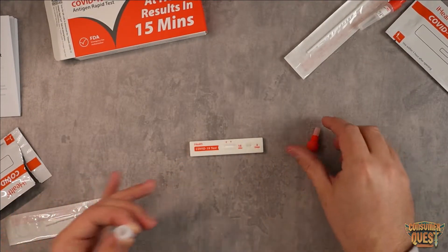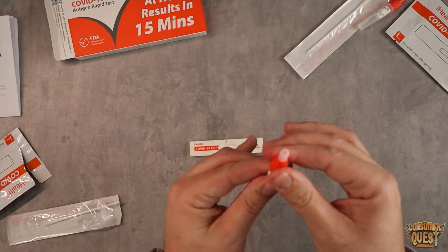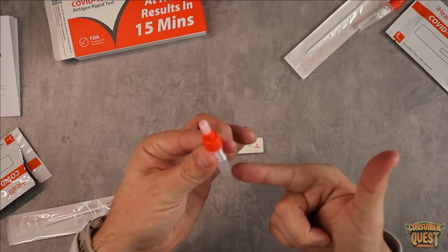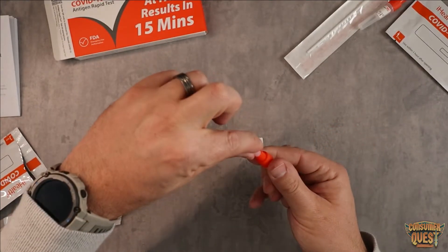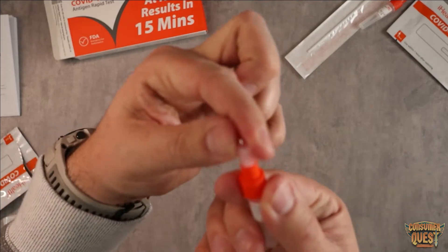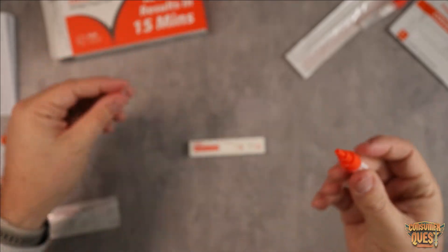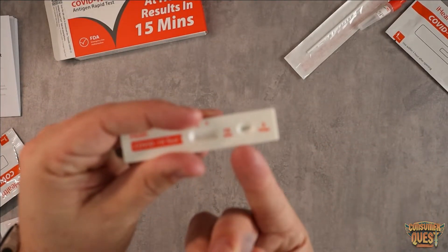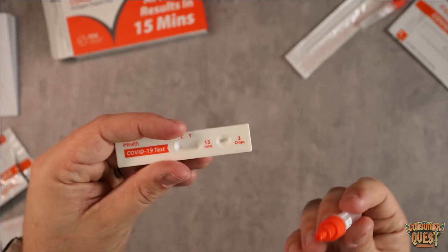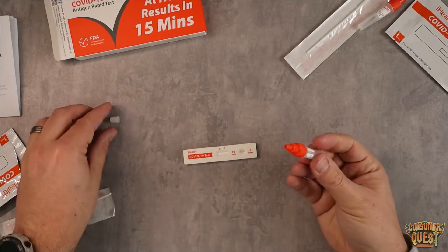Now put the swab off to the side, put that away, and put the lid back on. Now you've got the testing fluid — all the fluid from my nose — inside the container. What I'm going to do is unscrew the little cap on top, the small one right here, and then take this fluid and put three drops into this little dot right there. So we're going to do one, two, three, and that is it.